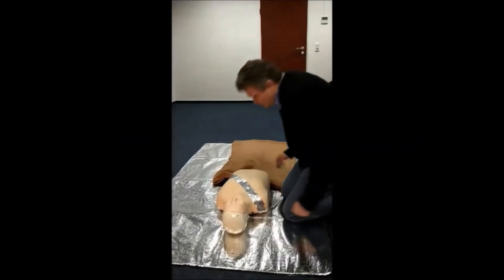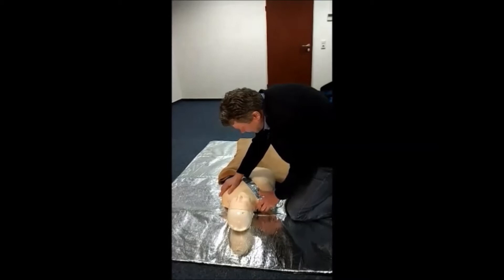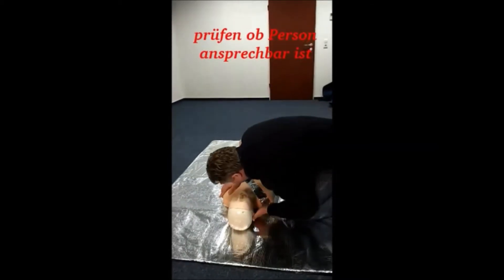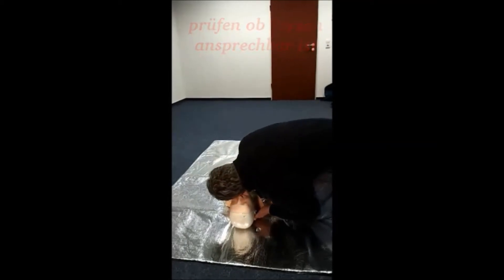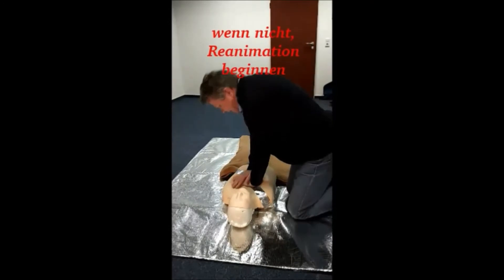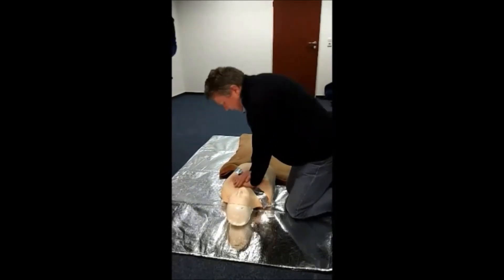Ich habe jetzt hier unser Gerät herausgelöst und renne ganz schnell zu Anne, denn die braucht das ganz dringend. Hallo, hallo. Die Person reagiert nicht. Sie atmet auch nicht. Ich habe technische Hilfe geholt.